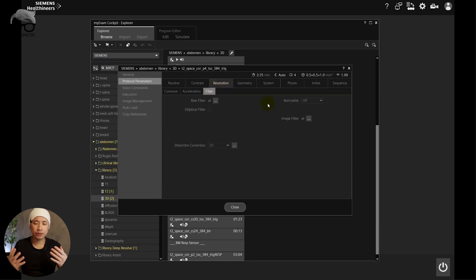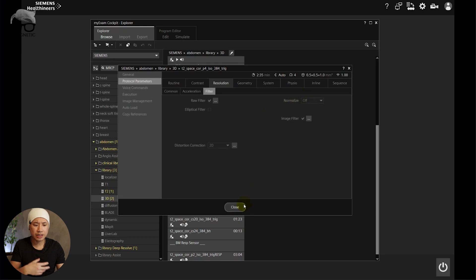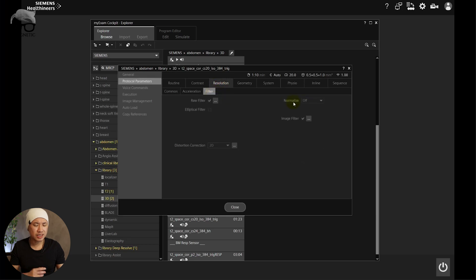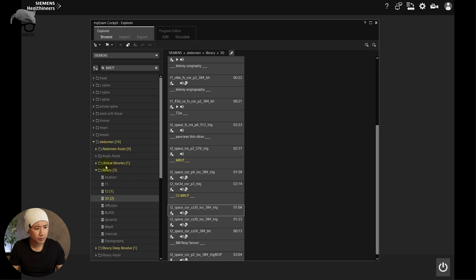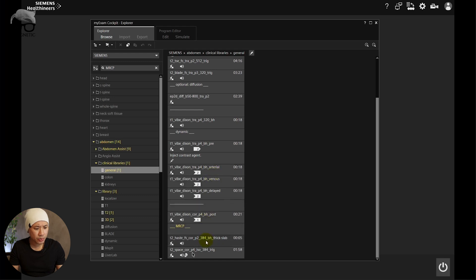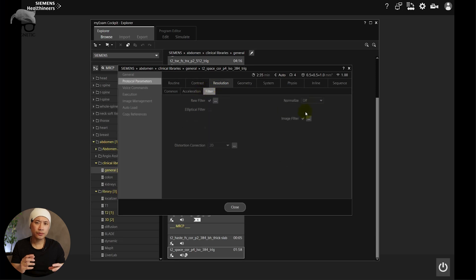Let's open the first one with CAIPIRINHA. Go to Resolution, then go to Filter, and you can see here that pre-scan normalize is set to OFF. That makes a huge impact on image quality — it should be ON in my opinion. So it's off here. I took the sequence, tested it out, and the image quality was great but something was missing — that punch of quality. Now let's open the compressed sensing one — go to Filter — it's also off. Let's go to the clinical library under General, locate MRCP at the bottom, check it out — it's still off there too.